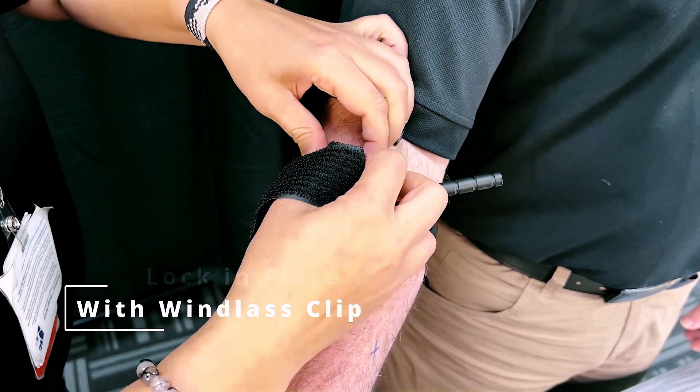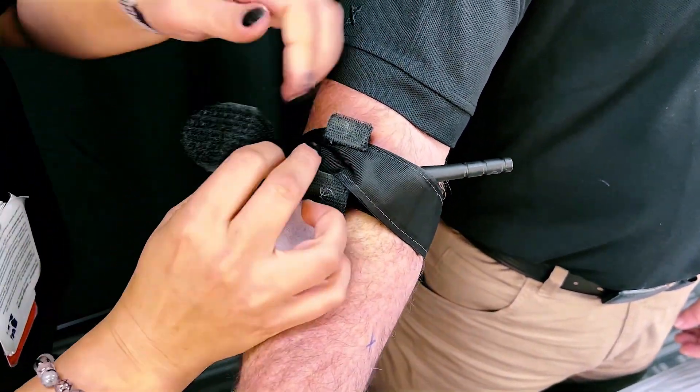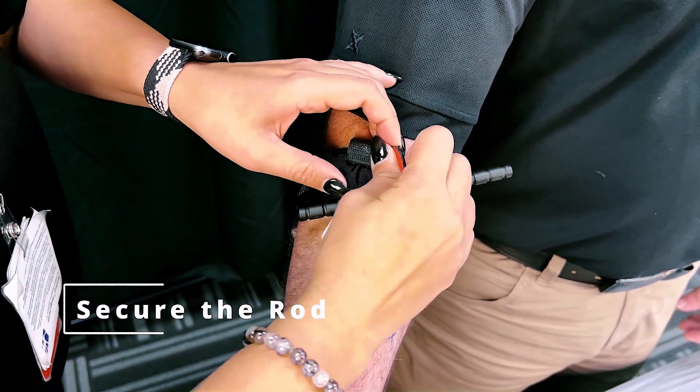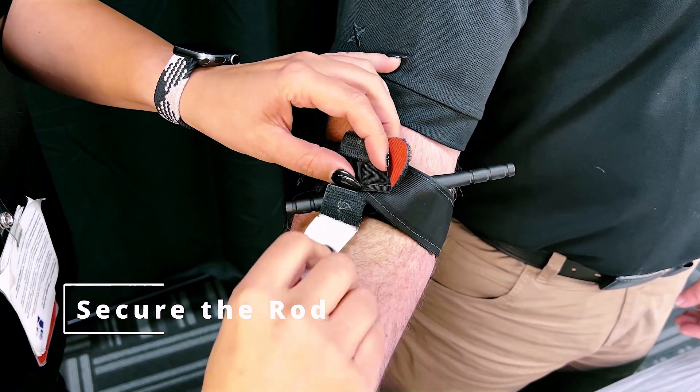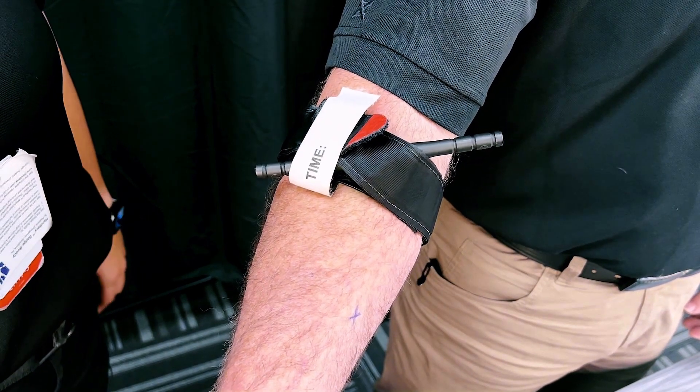Lock the rod in place with the windlass clip. This will prevent the band from loosening and ensure that bleeding remains under control. Secure the rod with the strap by adhering it tightly to the windlass clip. This will ensure that the rod does not come loose and the band remains in place.